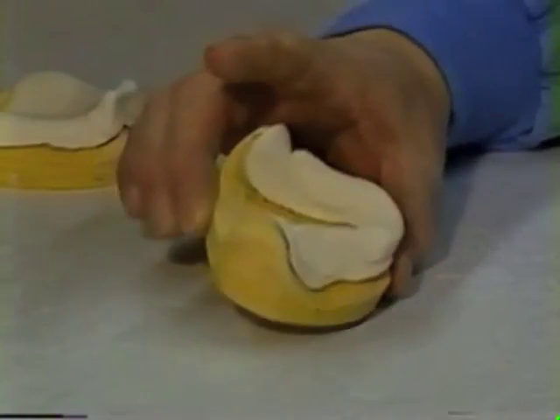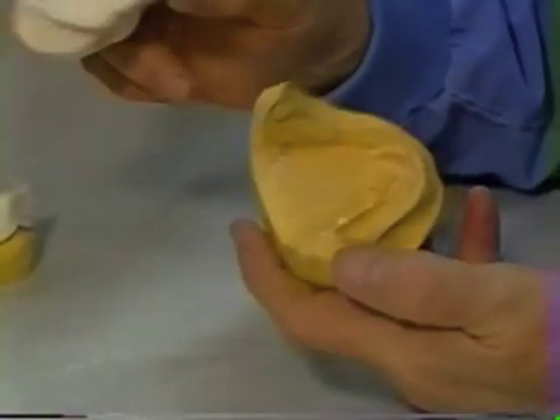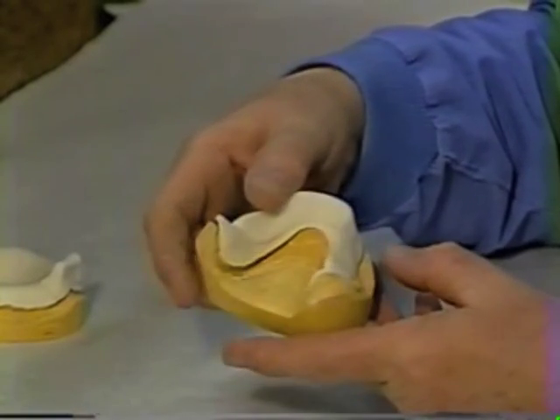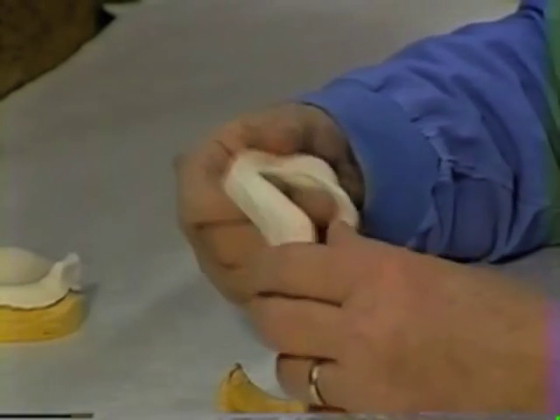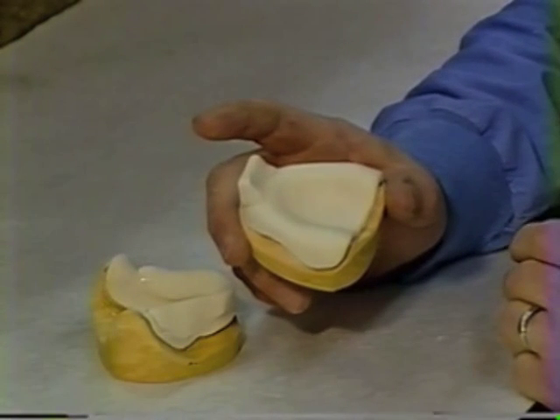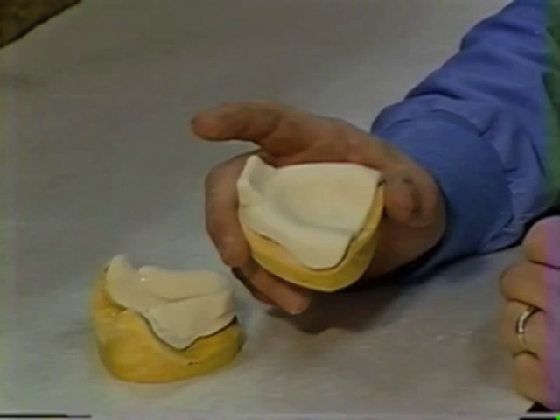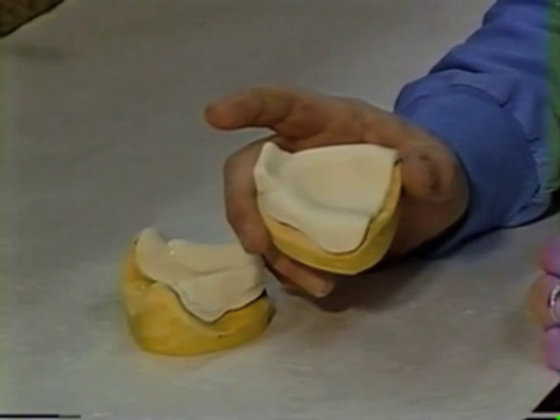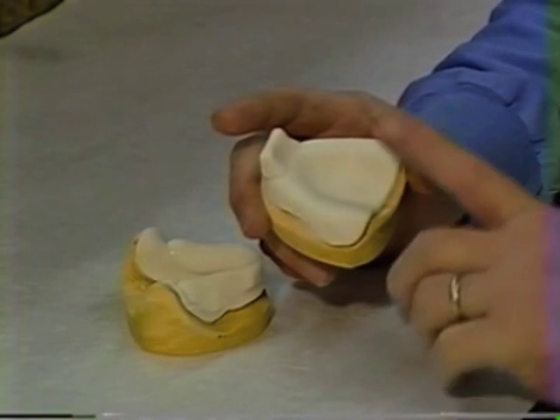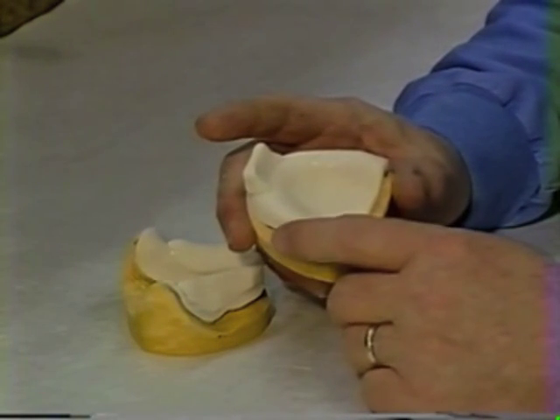There are our trays, ready for scrubbing up and going to the patient's mouth. Once you've finished trimming, scrub them up so they're nice and neat and clean — the patient is going to see all this, so you'd like it to be presentable. Inspect the tray and go around the peripheries to make sure you haven't left any sharp areas that might injure your patient. Note that with proper handling of the material, you do not need to polish them — you do not need to use pumice on them with a rag wheel. If you do it properly, the material will turn out nice and smooth and presentable to the patient.